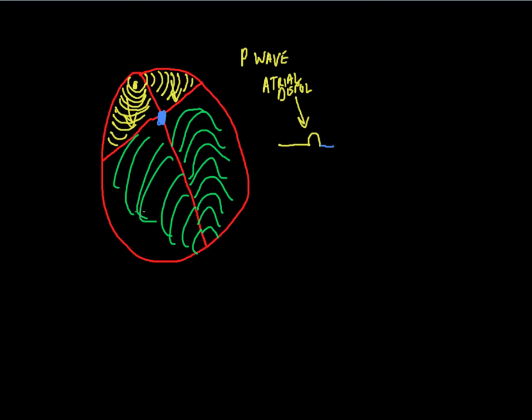Well, when you see this happening, it's a massive number of cells. There's a huge amount of electrical energy. And the other videos that I'm linking get into a little more depth on there, but for your purposes, this idea that there's a huge number of cells in the ventricles, vast numbers, thousands of times the number of cells that there are in the atria. What happens is, you'll get this big, tall, up-down, spiky, pointy thing, as I like to refer to it.